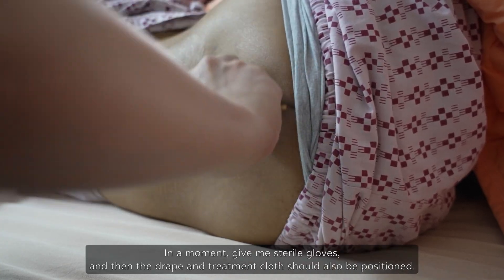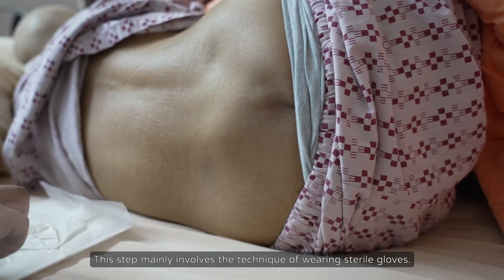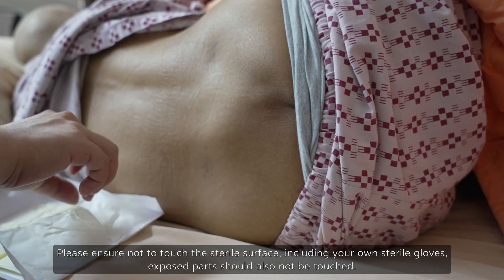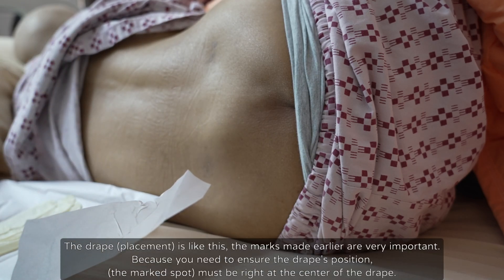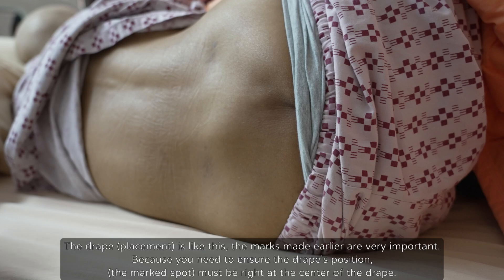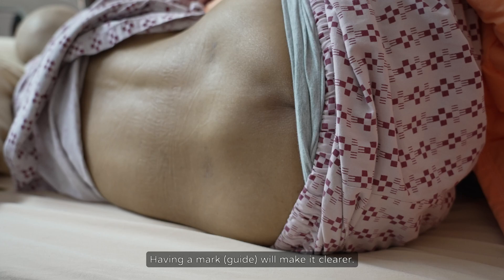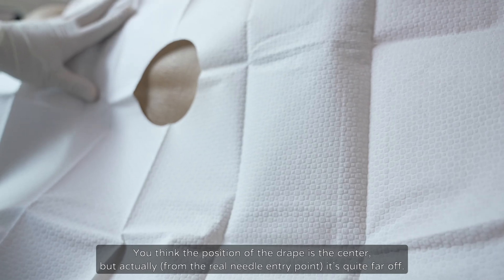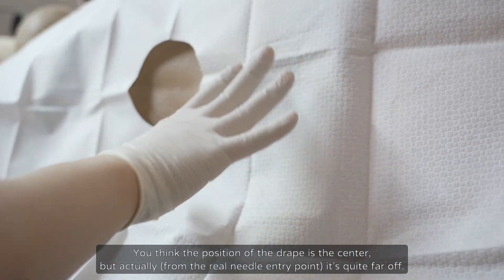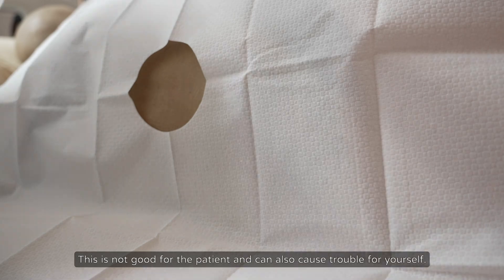Next, put on sterile gloves, then position the drape and treatment cloth. This step mainly involves the technique of wearing sterile gloves. Please ensure not to touch the sterile surface, including your own sterile gloves; exposed parts should also not be touched. The marks made earlier are very important, because you need to ensure the drape's position — the marked spot must be right at the center of the drape. Having a guide mark will make it clearer, because there have been incidents where the drape was not placed correctly. You may think the position of the drape is at the center, but actually from the real needle entry point, it's quite far off. Once the target is off, your subsequent targets will be increasingly off, which is not good for the patient and can also cause trouble for yourself.